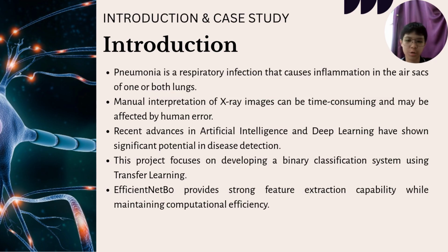The introduction of our project: pneumonia is a respiratory infection that causes inflammation in the air sacs of one or both lungs. It is a serious health issue, especially for children and elderly patients. Chest X-ray images are commonly used to detect pneumonia. However, manual interpretation by medical professionals can be time-consuming and may be affected by human error. With the recent advances in artificial intelligence and deep learning, automated disease detection systems can help support medical diagnosis.